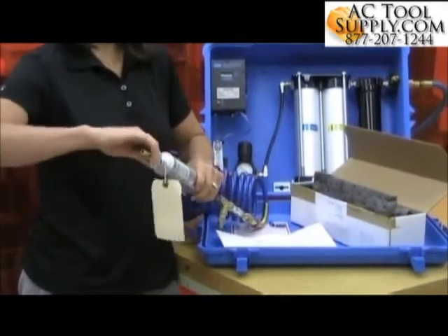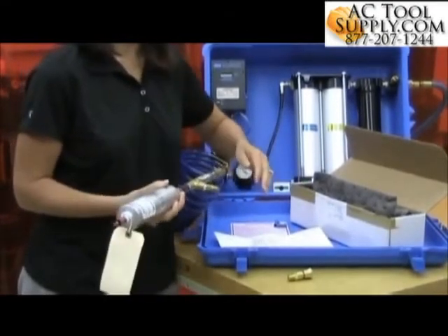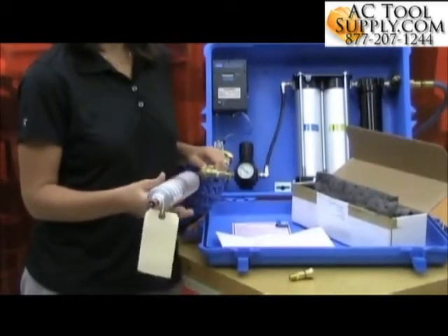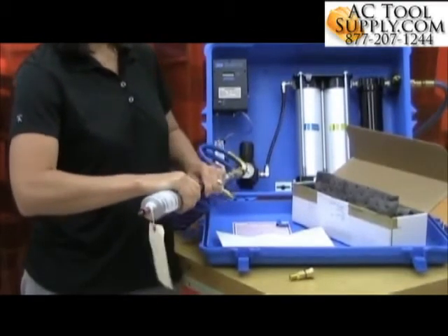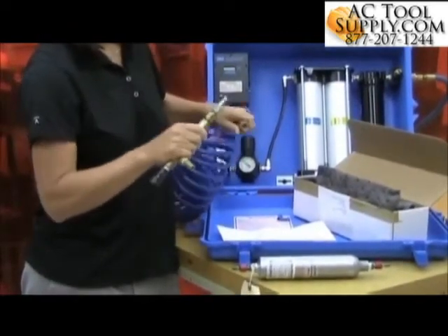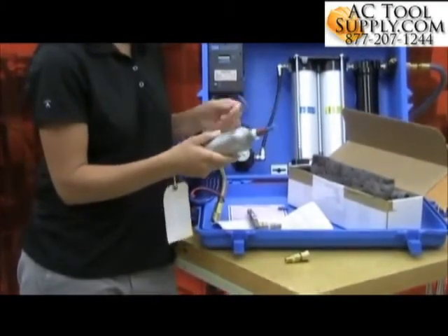Once that's done, I can remove the end fittings. And almost immediately, I hear air escaping through the release valve, so I know that my canister is full of the test sample. I'll release this fitting and then this one, and place the caps back on the canister.